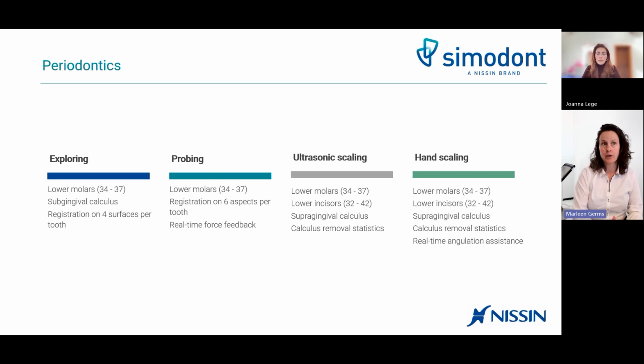The probing cases we haven't improved, but I think it's really interesting to see that we have introduced there real-time force feedback, so that you can really see how much force you put on the tip of the probe. We are expecting to improve the cases of probing in the next release.